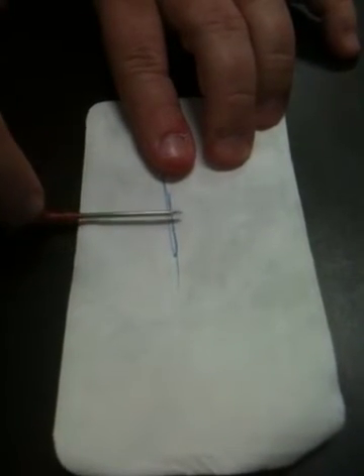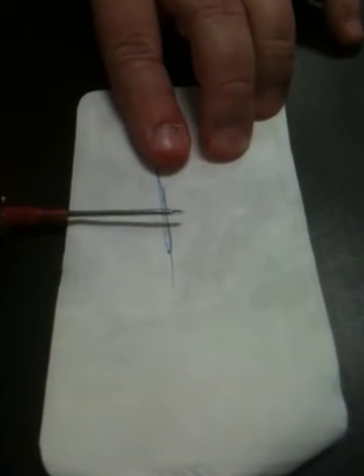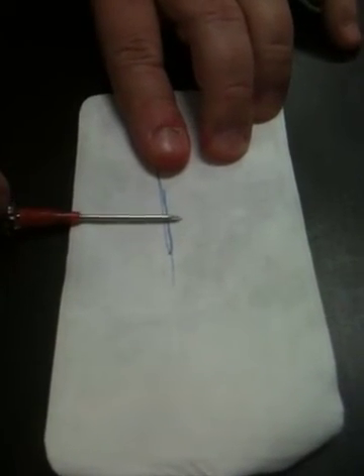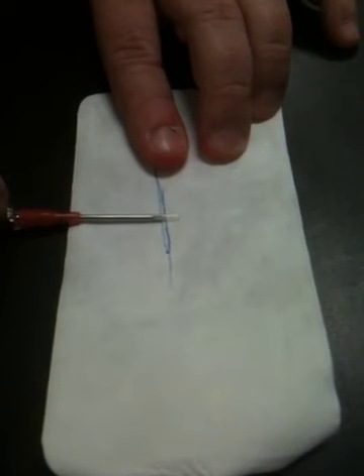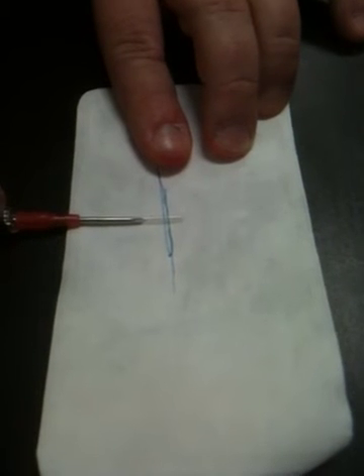Versus when you're trying to just pull the needle back, you're not getting any more of the cannula in the vein. You've got that much. All you're doing is just pulling the needle back out. So you don't have any more to go to.